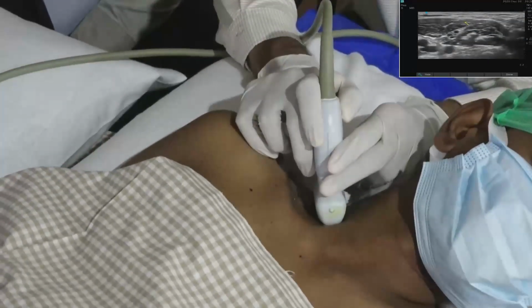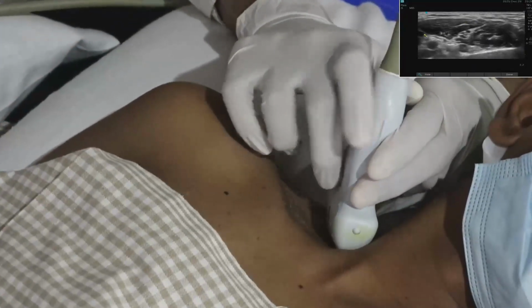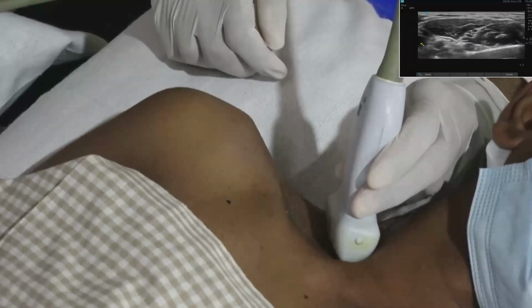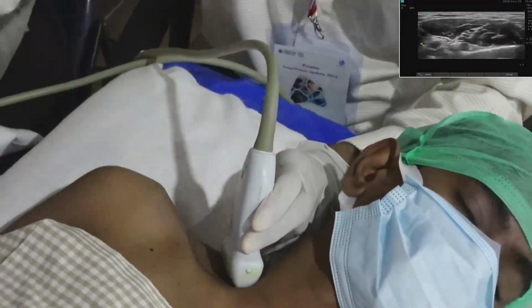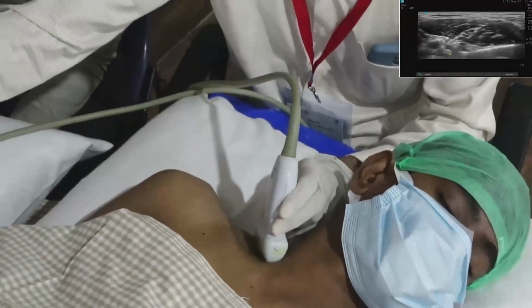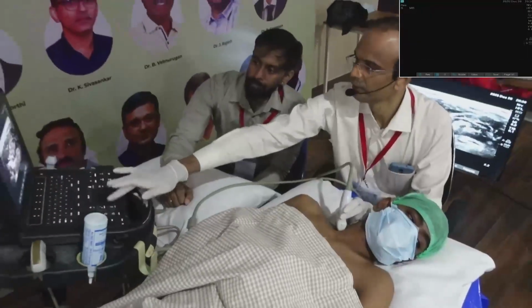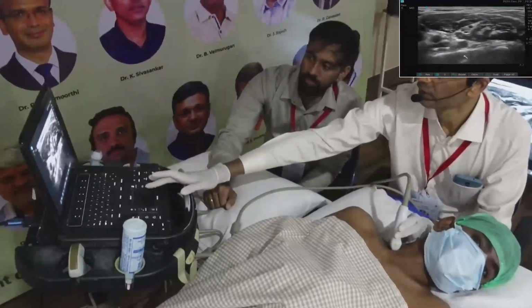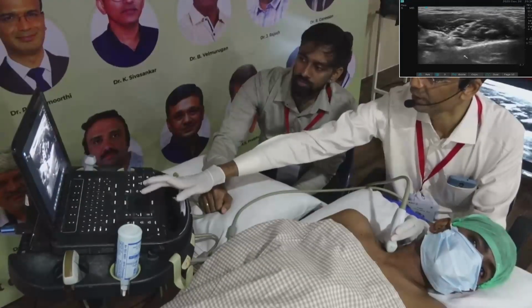Now again, these are all the components, especially C8 and to some extent T1 is also visible. Here two components are there. Probably the one component which is coming out of the thorax is T1 and trying to form C8 T1 here.